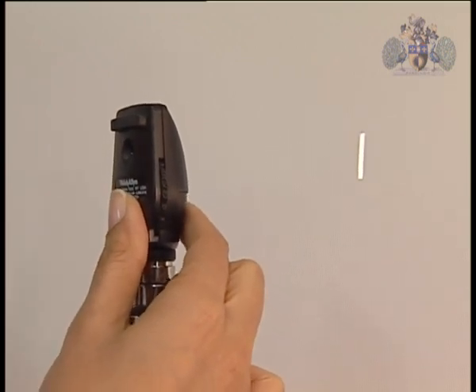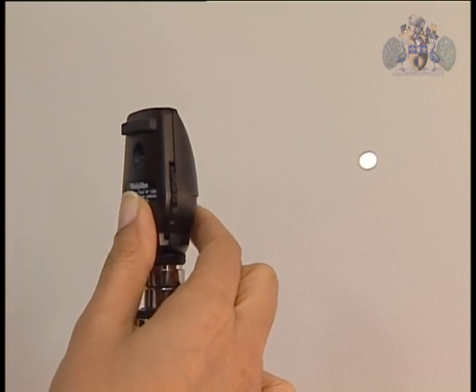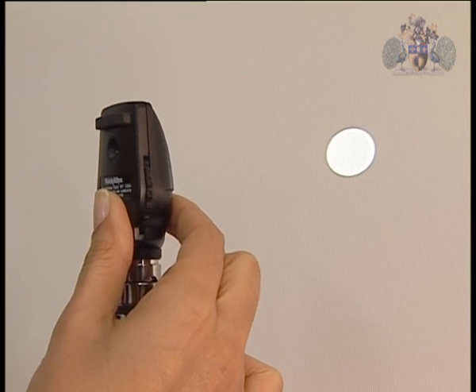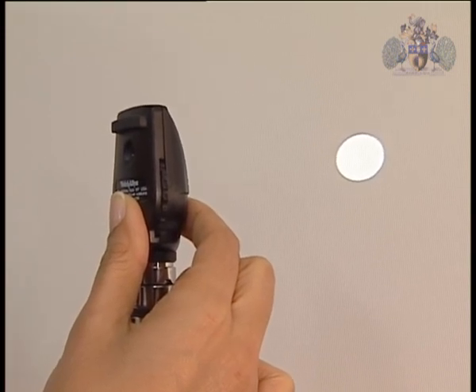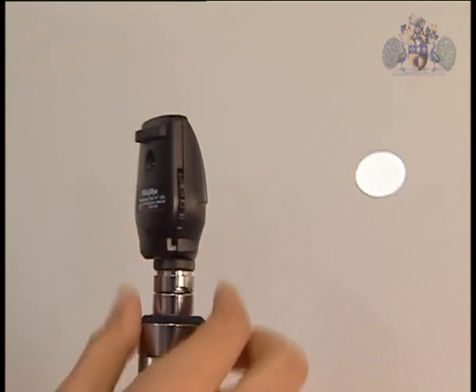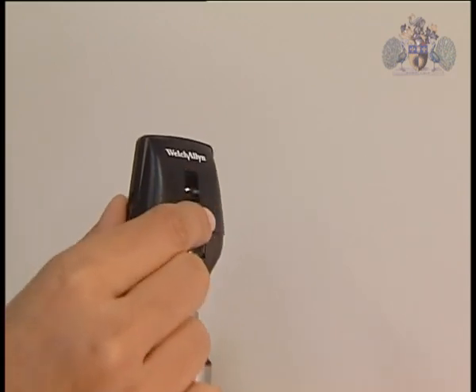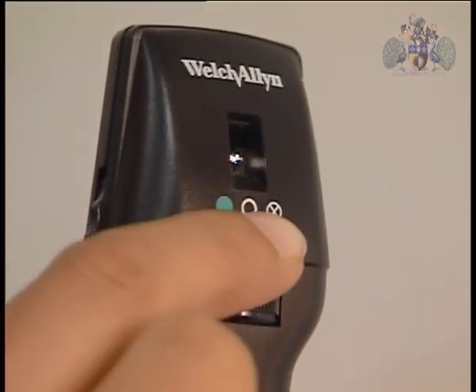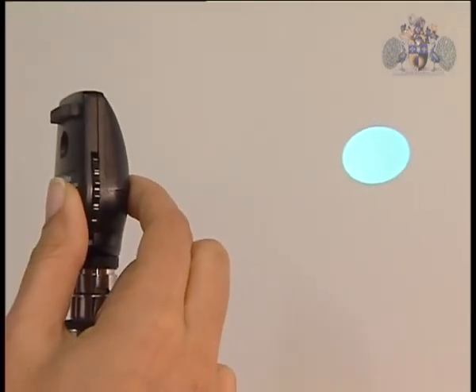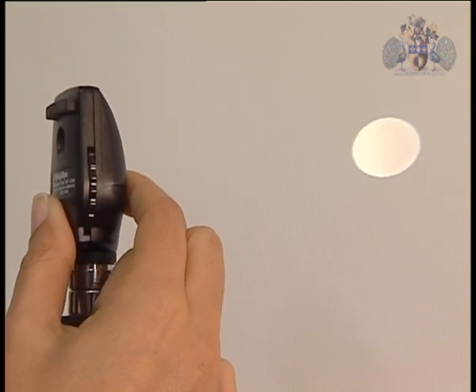Crosshairs, slit beam, blue filter, small plane disc, medium plane disc, and large plane disc. The large plane disc is the setting you want for fundus examination. Some ophthalmoscopes also have another filter at the top, which may be a switch. This has a green filter, a bright filter, and a dim filter.